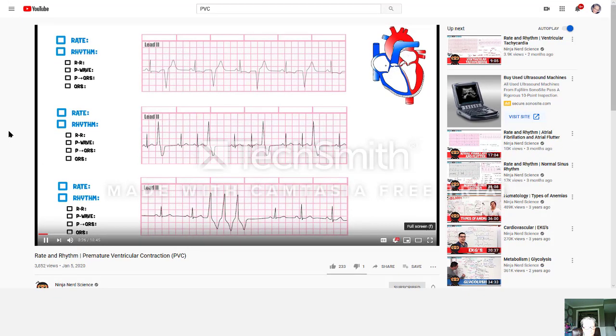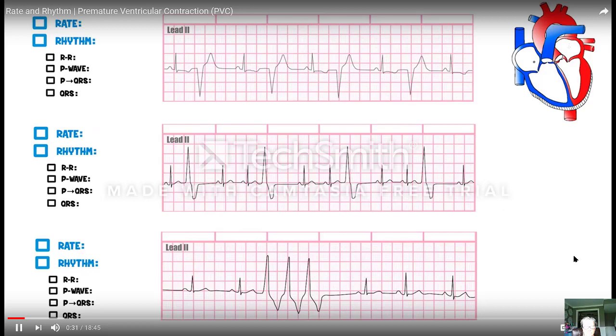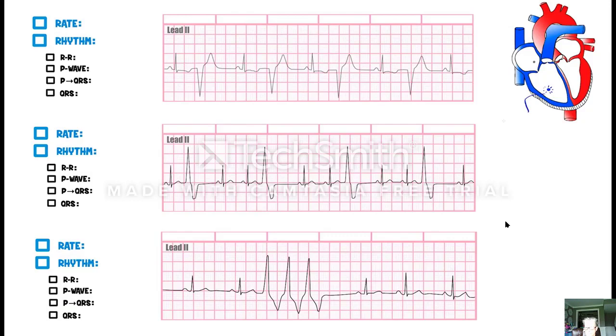All right, so let's imagine, again, just like we saw with the ectopic atrial focus within the atria, there could be some type of irritable focus. In the same way, you could have some type of irritable focus within the ventricles. And this little dude, he can be a little agitated. What can agitate this ventricular focus? So let's say here's our ectopic focus, right? So there's a little irritated tissue. What irritates this little dude? It could be hypoxia, right?